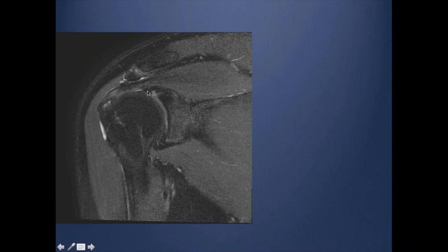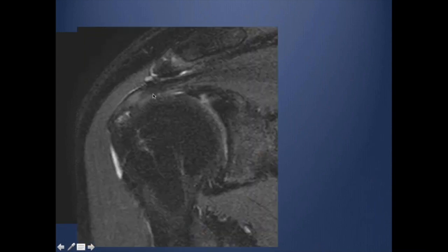And in this case, you can see it has more of a globular appearance and does not have a smooth outline. This is another SLAP lesion as well.